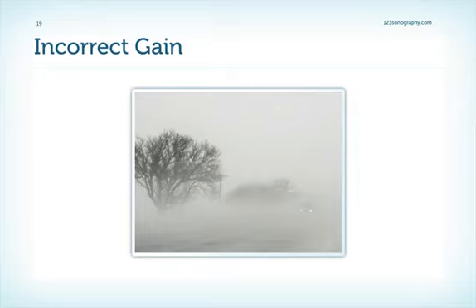You can also create artifacts if you use a false gain setting, in particular if you overgain the image. In this case, you not only lose lateral resolution, but you also tend to obscure the information. For example, you cannot appreciate the texture of a structure anymore. And you will also overestimate the size of structures. But here is a demonstration which shows you exactly what I mean.